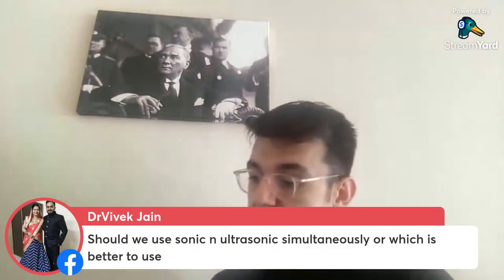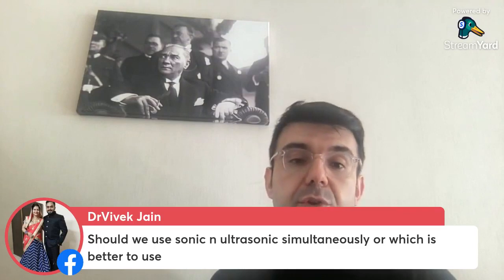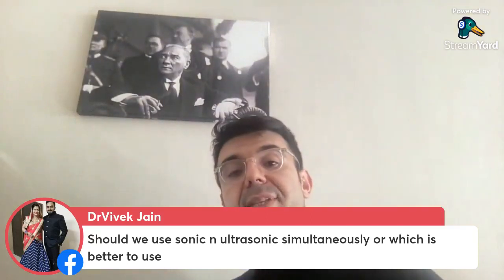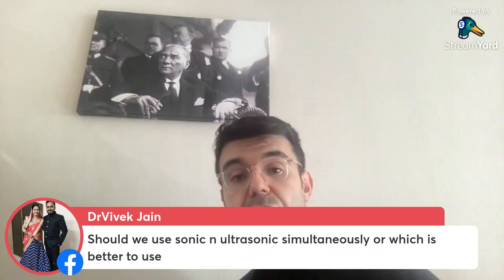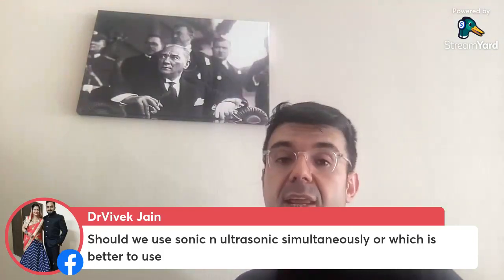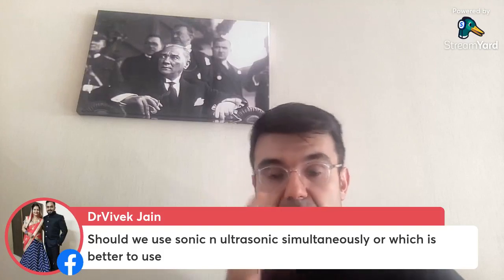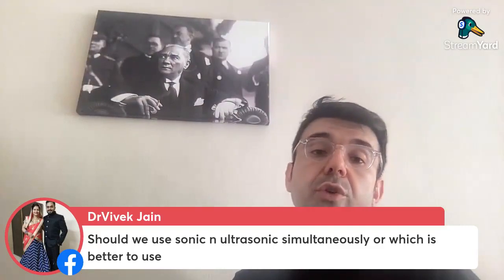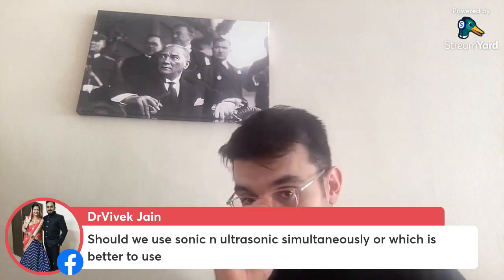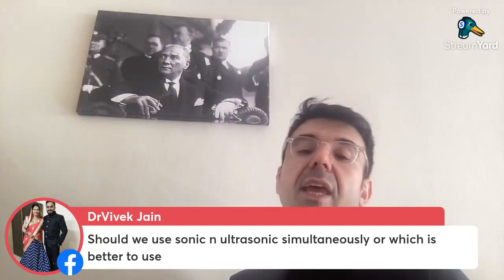Should we use sonic and ultrasonic simultaneously? Which is better to use? When you check the literature, some of the authors report that ultrasonic irrigation is better than sonic irrigation. Some of them say the sonic is better. But in my opinion, they have the same effect for the removal of debris from the root canals. My advice is that you should know how to use these systems in root canals. So you should do more practice. It will be very useful for you. And using passive ultrasonic irrigation in an intermittent way will be very useful for you.